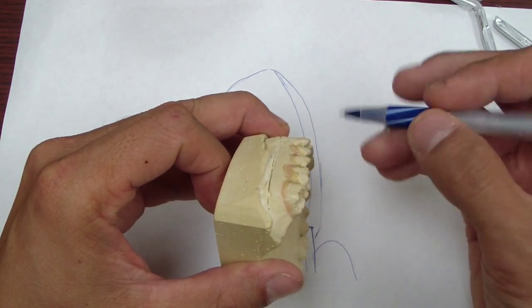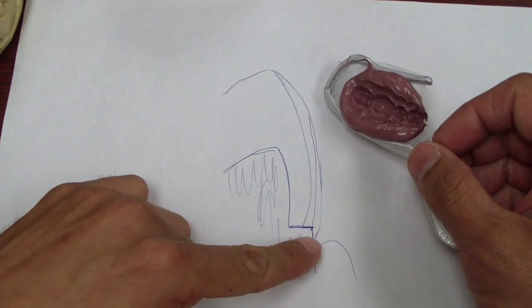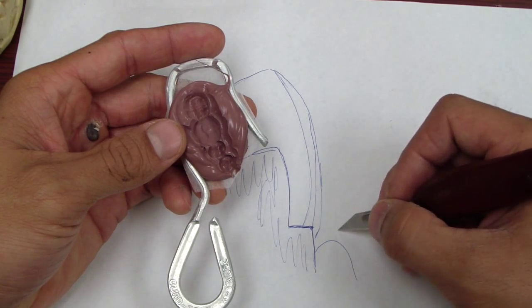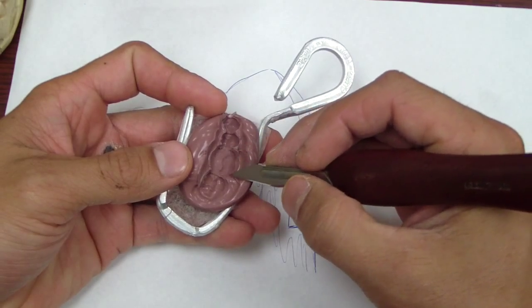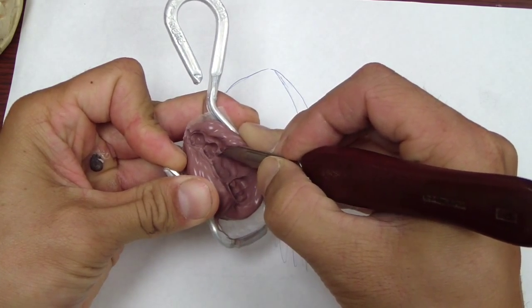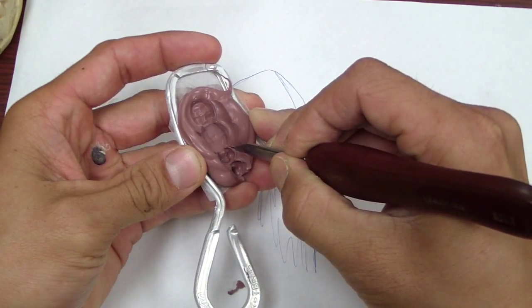When you go to polish after fabricating your provisional restoration you can polish back to the correct position. Aesthetically this matters, especially in the anterior — leaving a ledge can definitely affect the gingival contour, especially over an extended period of time. The gingival may grow over and you may have issues seating your crown. If you don't have diagnostic casts and you've just fabricated a stent, what you can do — as I've already done here — is take a really sharp number 11 or 25 blade and just remove this gingival portion of the stent.